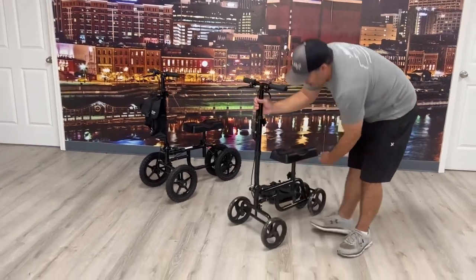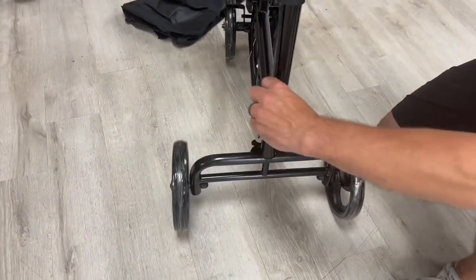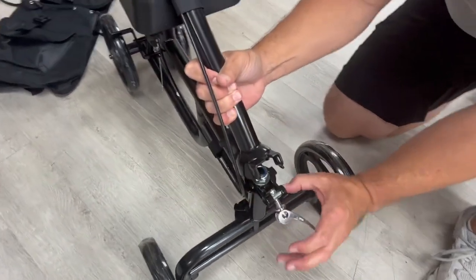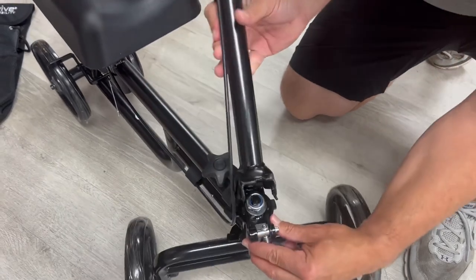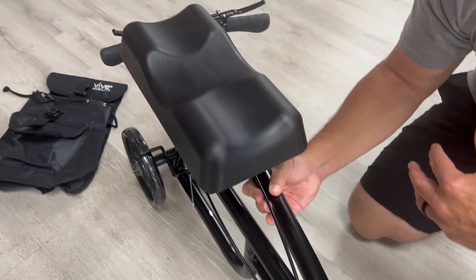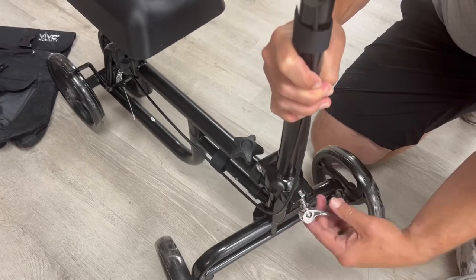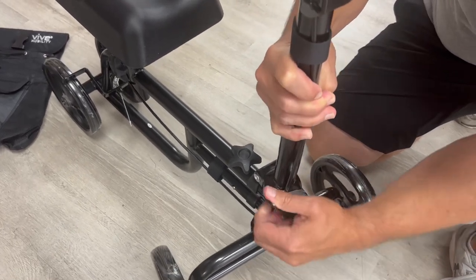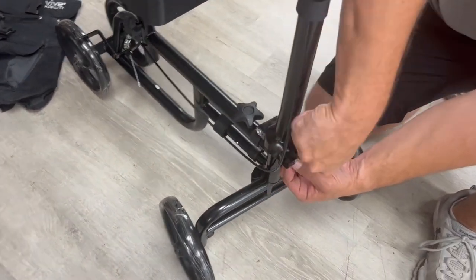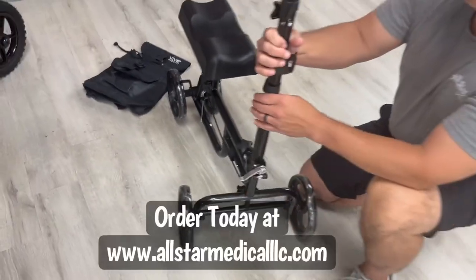When it comes to disassembling and folding this down for transportation, all you have to do is raise this lever up, pull it down — there's a little spring on the inside that allows the handle to fold flat, which makes it a lot easier for transport. To put it back, just push that in, raise it back up, and tighten. If it feels loose, turn this knob to tighten it up and that keeps it secure.